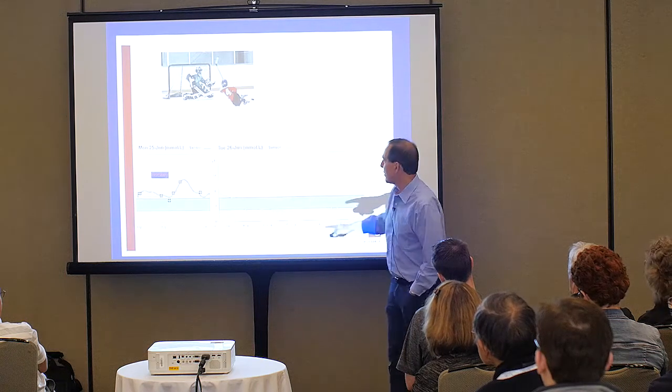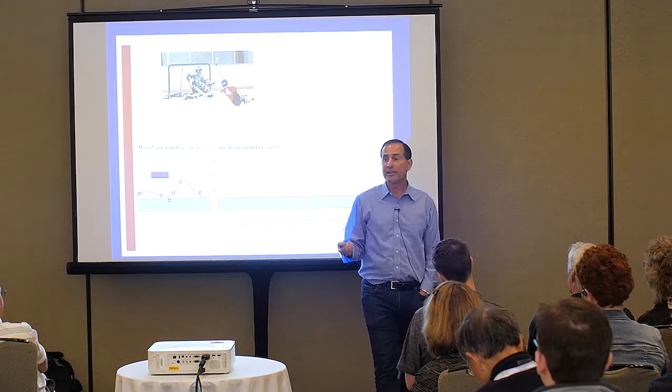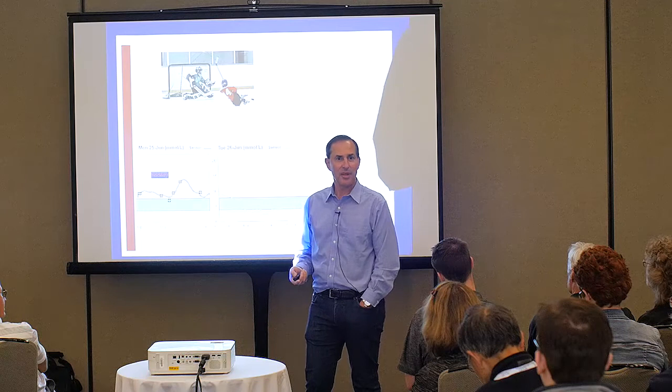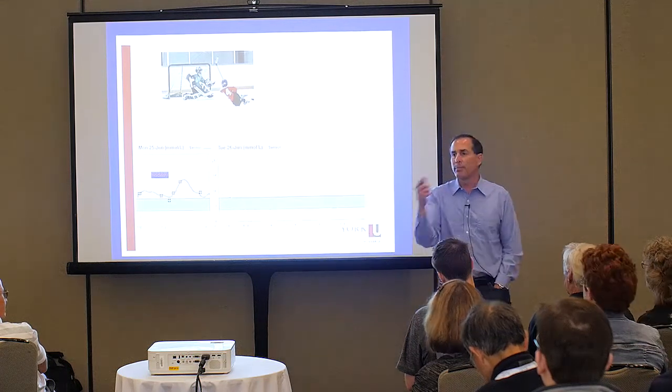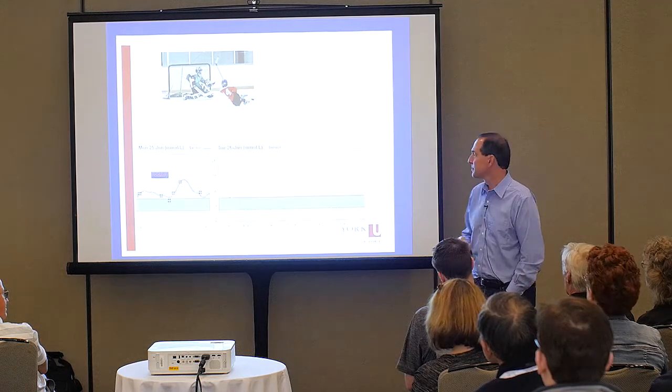So if this was your patient and you were giving them advice to avoid this, you'd probably tell them to do a temp basal reduction when they're going to bed. But not just for 1 or 2 hours, but for most of the night, if they know by historical precedent this is what happens to them.